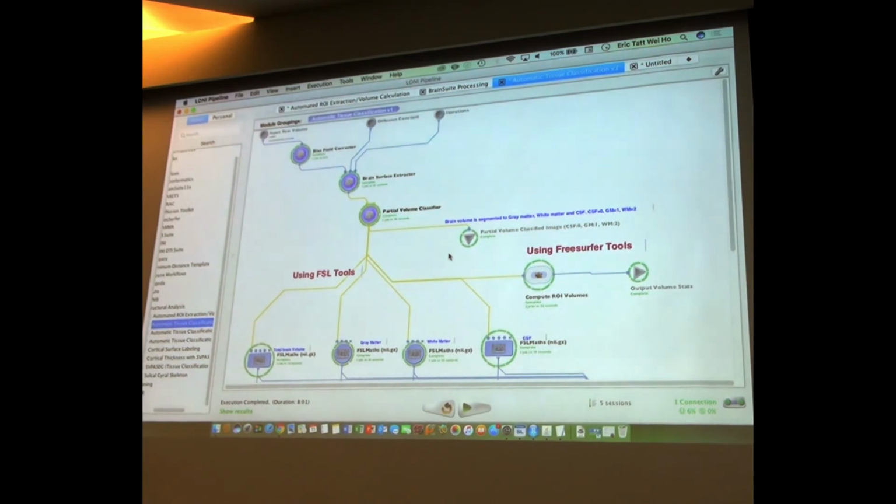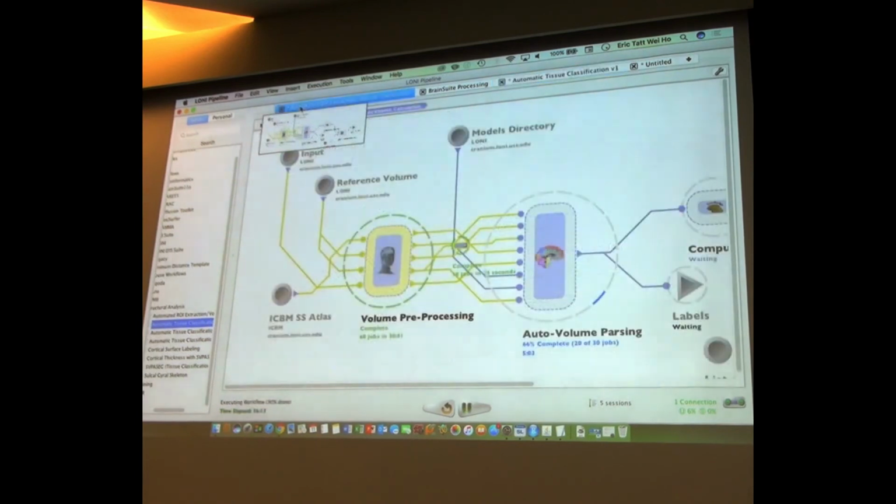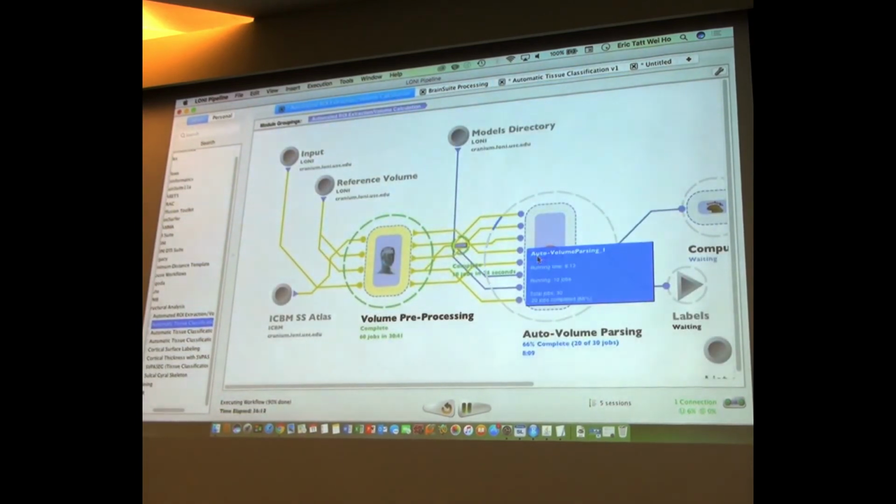They're global, they're not regional, but the regional ones will be done by tomorrow, and we're going to be able to see some of the results and talk about them. All right, so let's stop here.